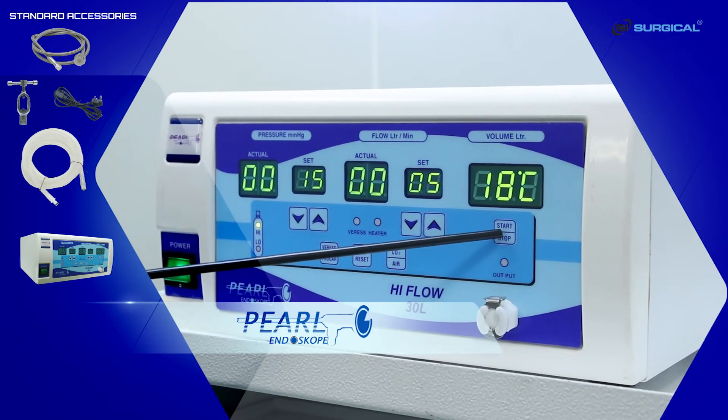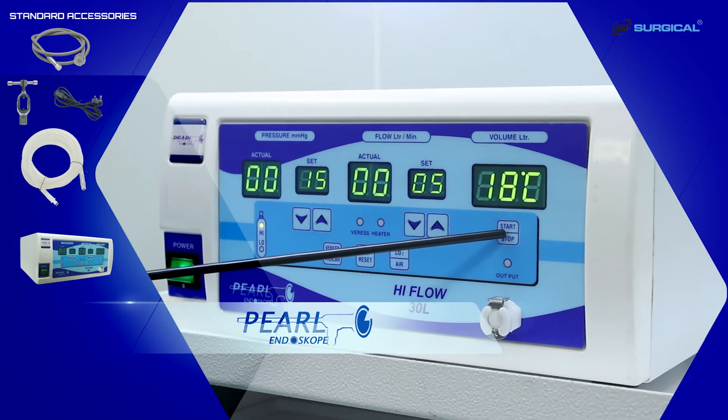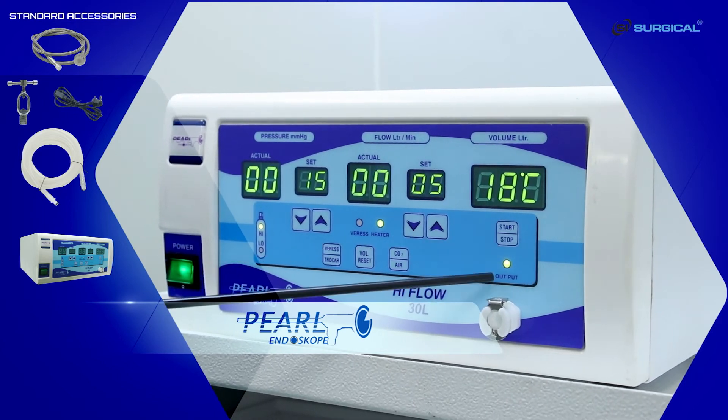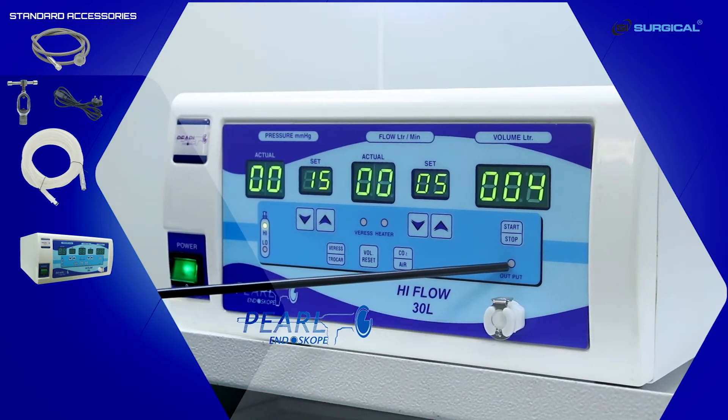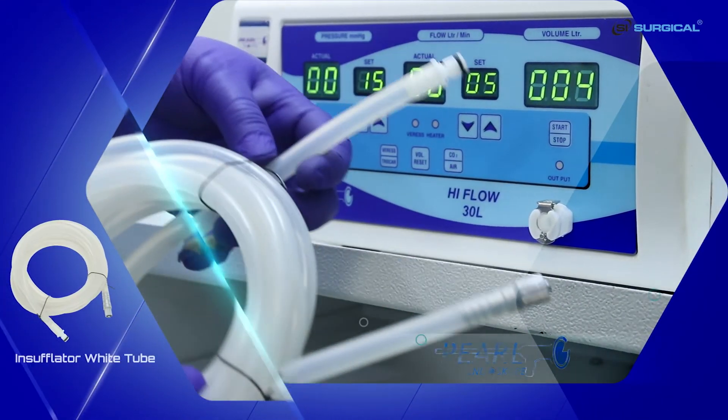These are the start and stop buttons. This LED lights up when the machine has started. When the LED is not lit, it means the machine is not active. This is the outlet pipe which is connected to the machine.